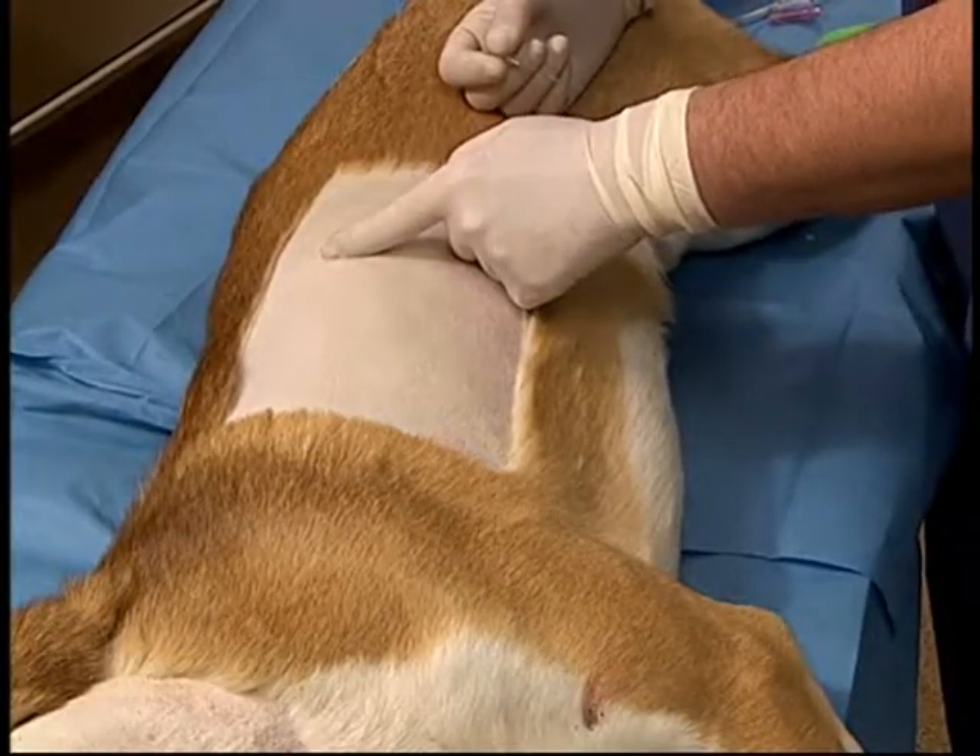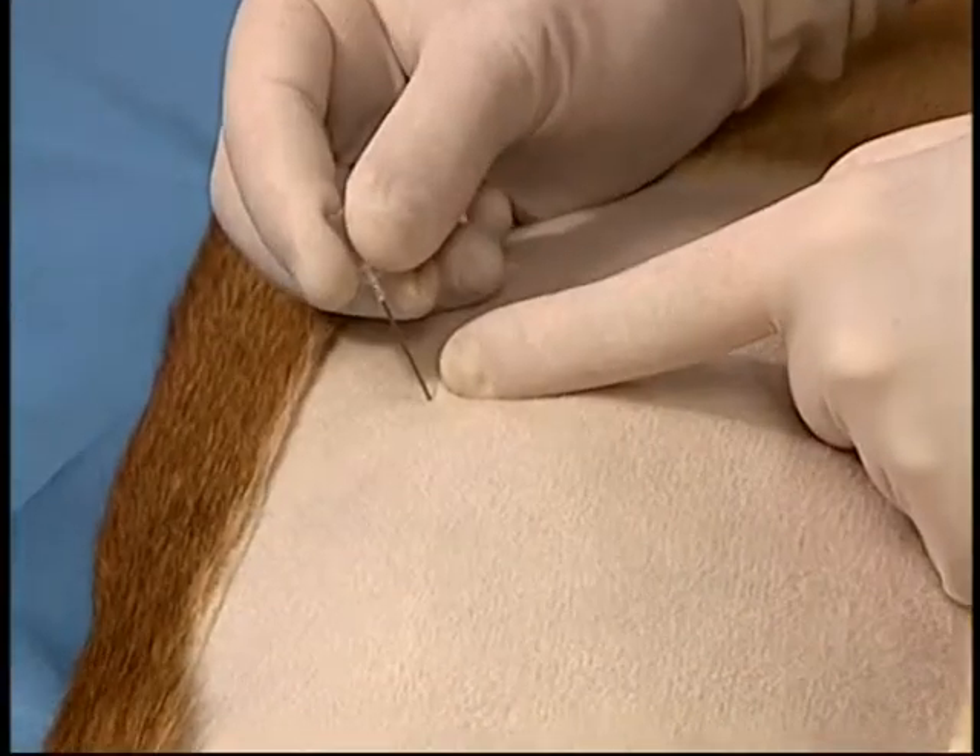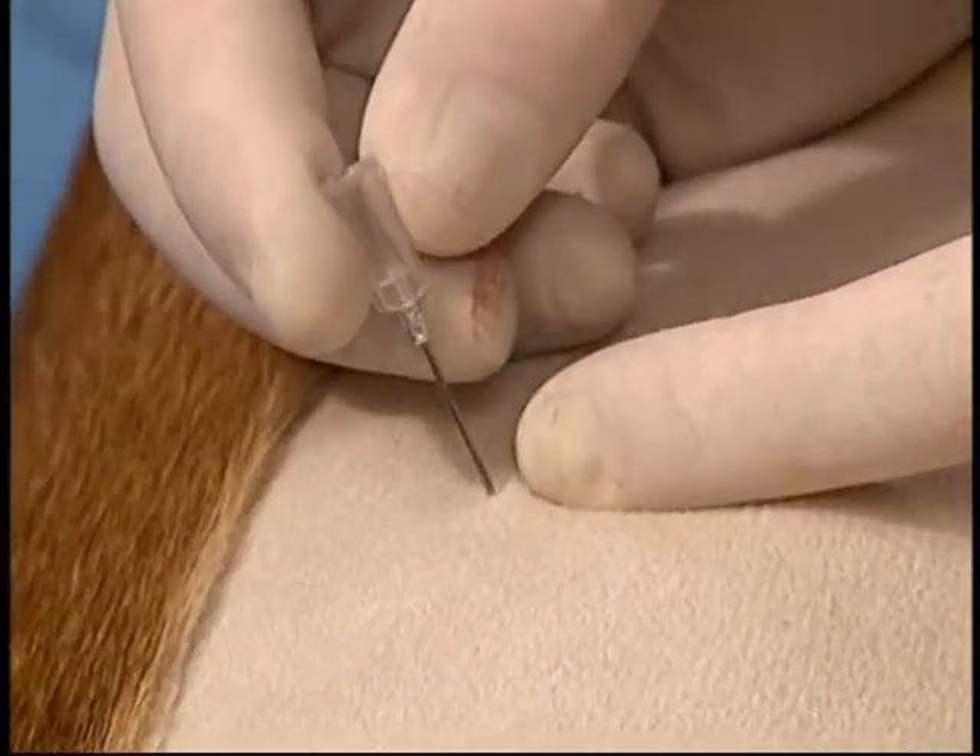This will be in the appropriate location. The needle is inserted into the skin — the dorsal third for air, ventral third for fluid.